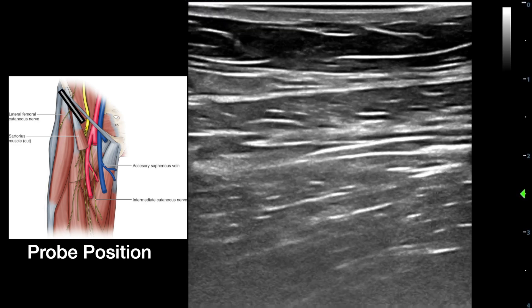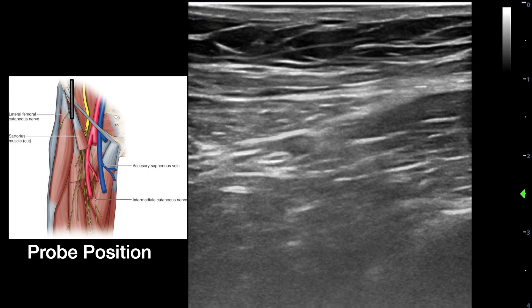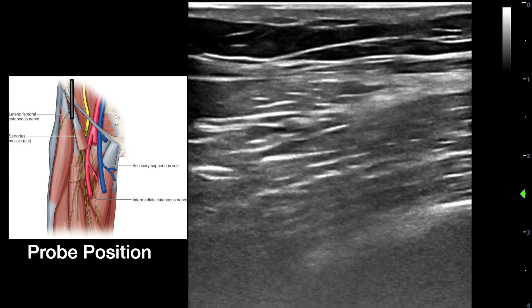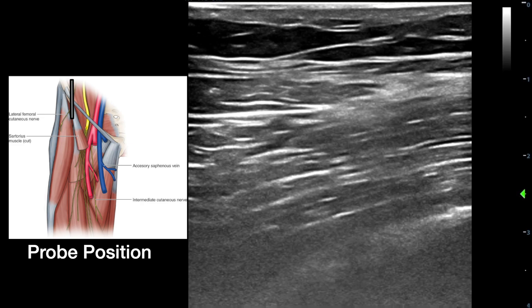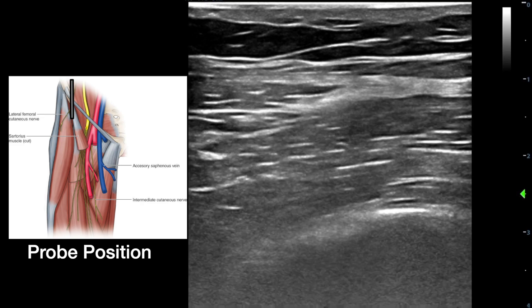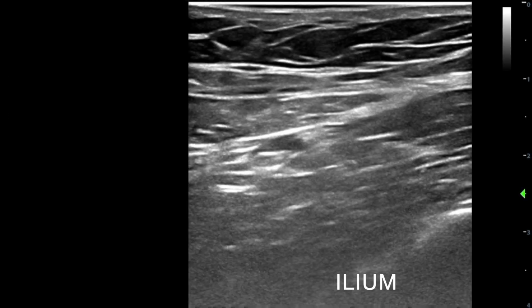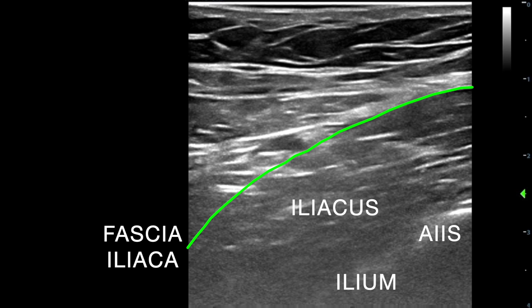The probe is then rotated to orientate it in its sagittal plane. Please appreciate the structures seen here: the iliac bone and anterior inferior iliac spine, the iliacus muscle, the fascia iliaca, the deep circumflex iliac artery, the internal oblique muscle, as well as the transversus abdominis muscle.